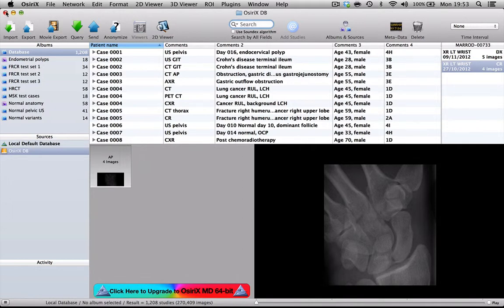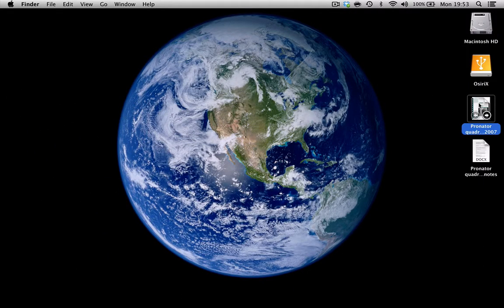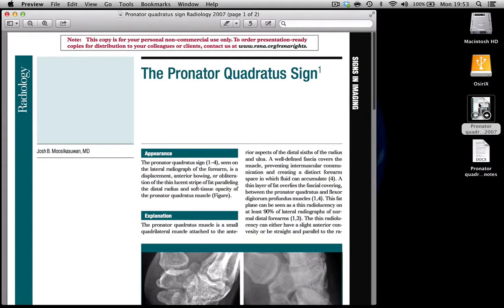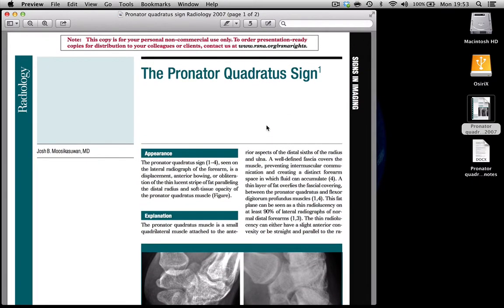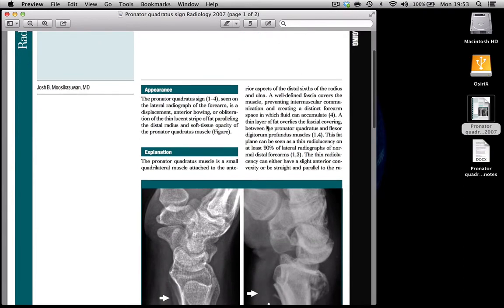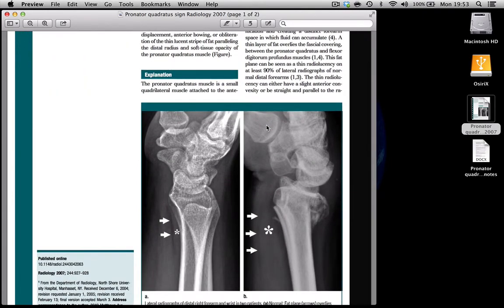So if we go back to the desktop, you'll see that on here I've put a nice article that I found relatively recently talking about the pronator quadratus sign of wrist trauma.